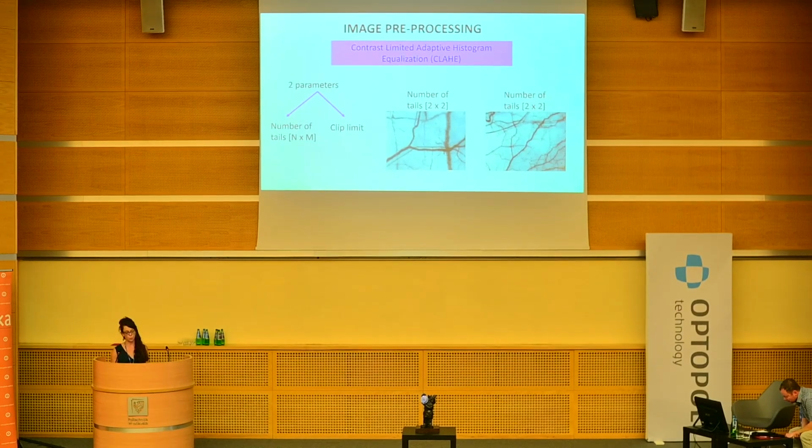When we take images of the conjunctival vasculature, we see that they can be very different, because with the slit lamp we take many different magnifications. We also have different illuminations. So at the end, one image is very different from another in terms of frequency content or illumination.